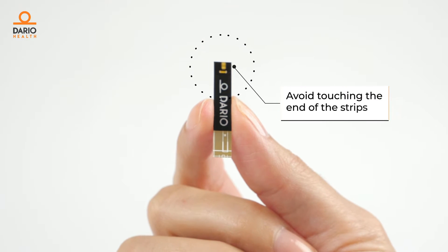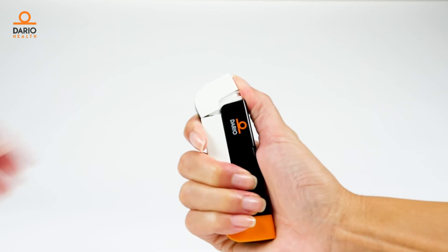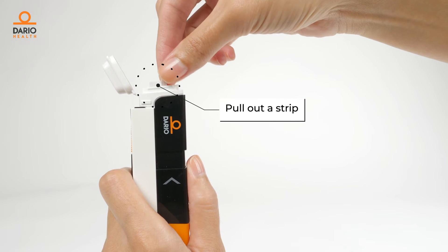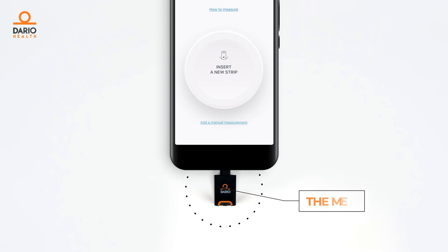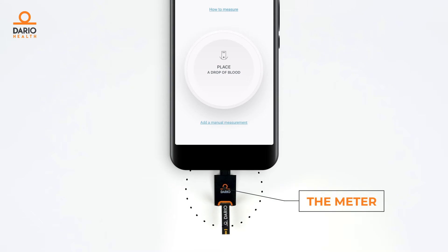Now we need to insert a new test strip. To do so, open the test strip cartridge cover and then the test strip cap like this. When prompted, insert the test strip into your meter with the gold contacts facing upwards.